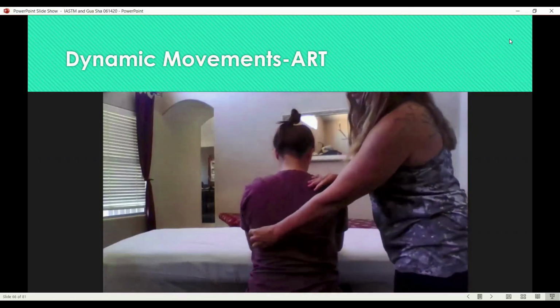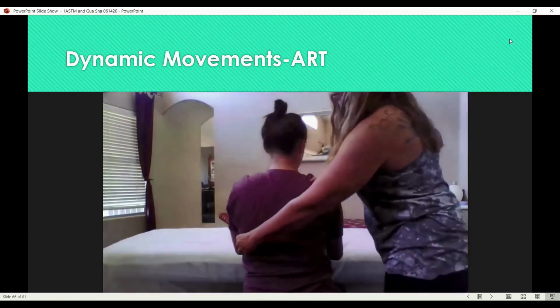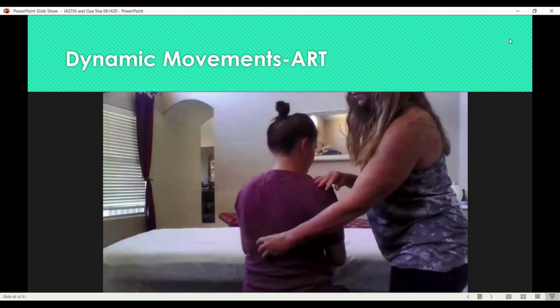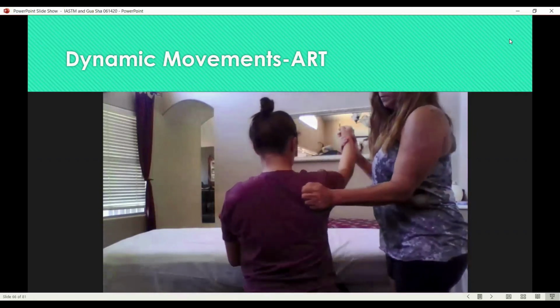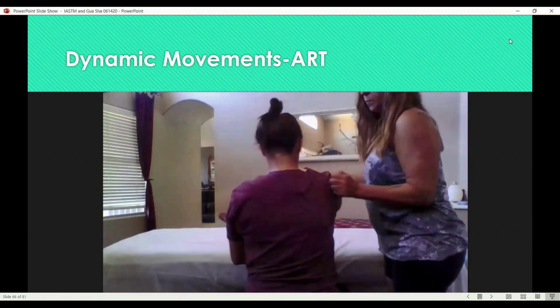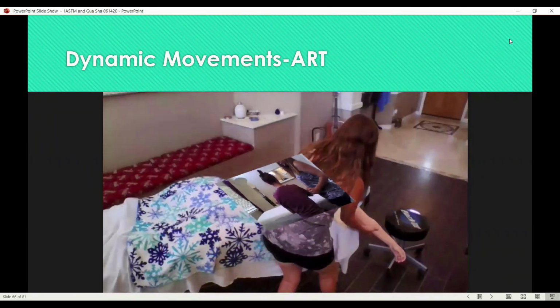Almost like that structural release where you dig in your forearms or fists into the back and have them do that. Here's doing some torso rotation, working on the intercostals, right? We could do any of these motions with our hands, but I'm showing ideas of how to use this with a tool, right? So we're more aimed with the fascia.